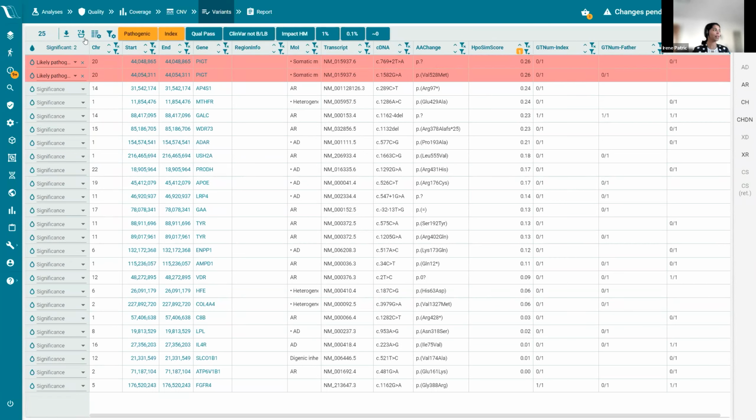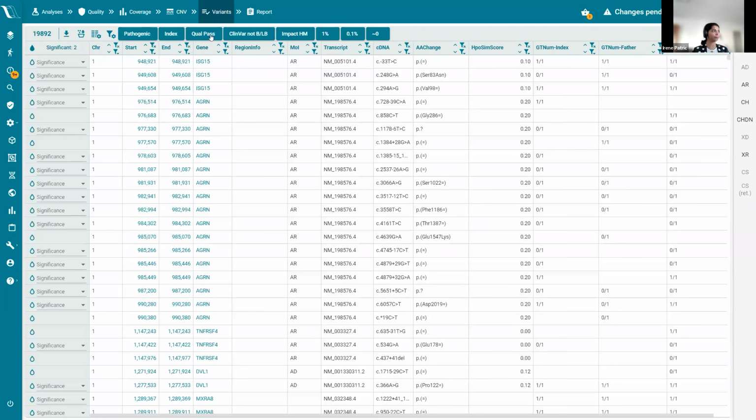So when we save the view, it goes to the report basket and also gets saved as an attachment, which I will show you a little later. Now, as in the other case, I can continue to apply the other filters.